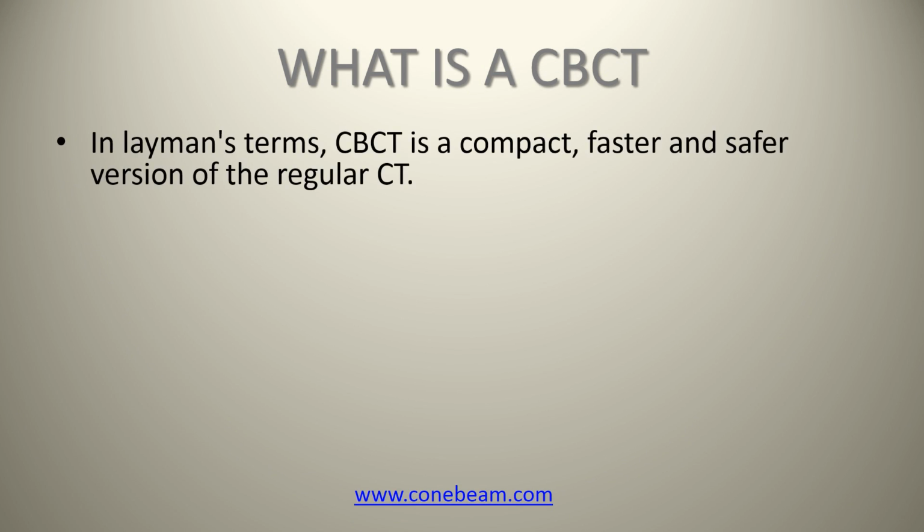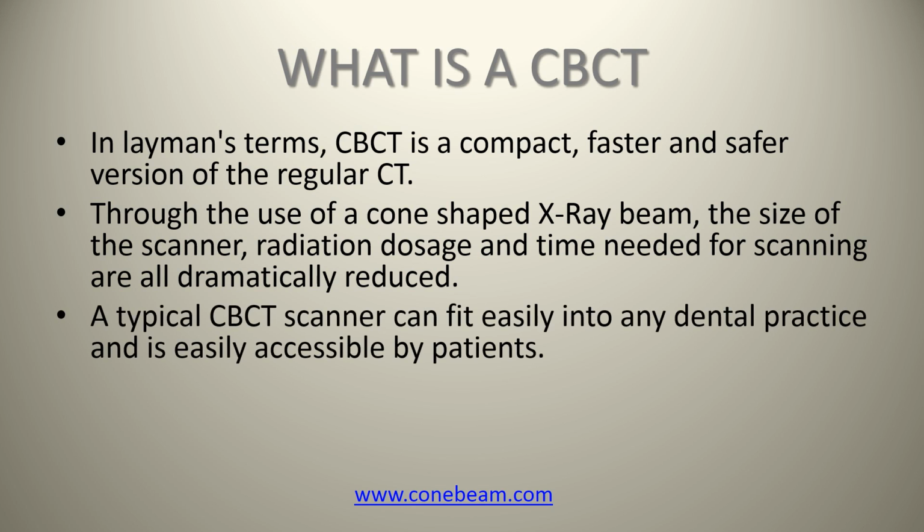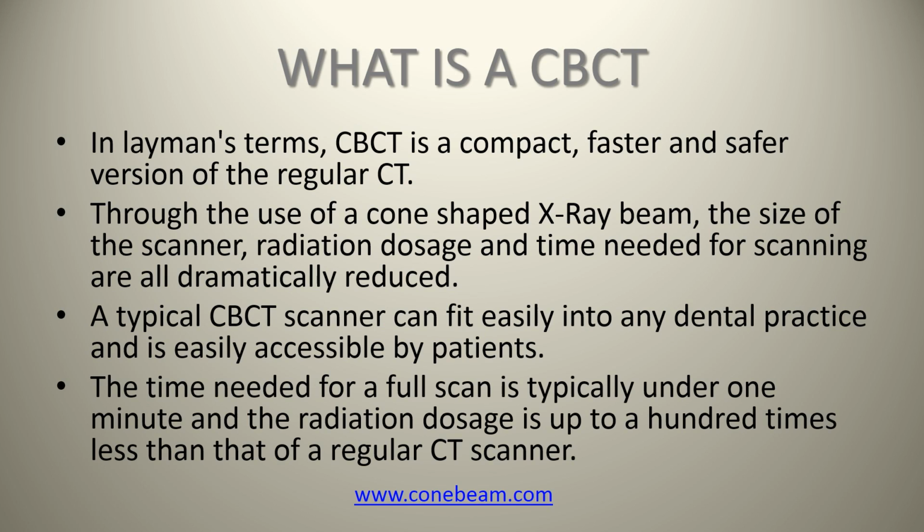In layman's terms, CBCT is a compact, faster, and safer version of the regular CT. Through the use of a cone-shaped X-ray beam, the size of the scanner, radiation dosage, and time needed for scanning are all dramatically reduced. A typical cone beam CT scanner can easily fit into any dental practice and is easily accessible by patients. The time needed for a full scan is typically under 1 minute, and the radiation dosage is up to 100 times less than that of a regular CT scanner.